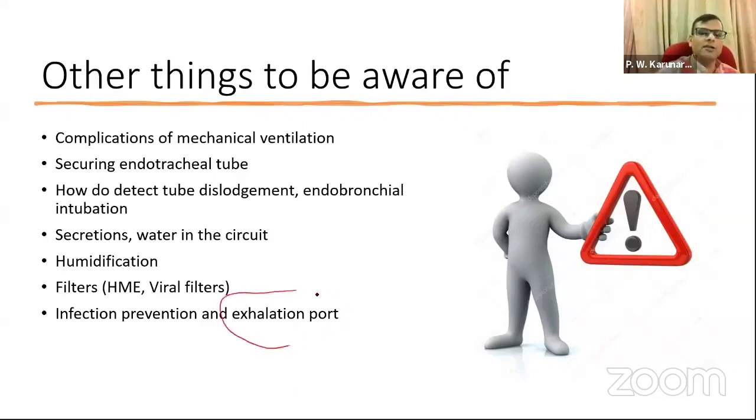One thing I wanted to tell: I have seen some other groups of people try to improvise certain things to kill viruses coming out of the exhalation port. Don't attach any longer tubings and hang them, dipping into fluid columns. I mean, you can do that if you know what you are doing, but it can harm the patient. And don't ever use heated elements at the exhalation port to kill viruses, because oxygen and high temperatures are not a safe way of managing.